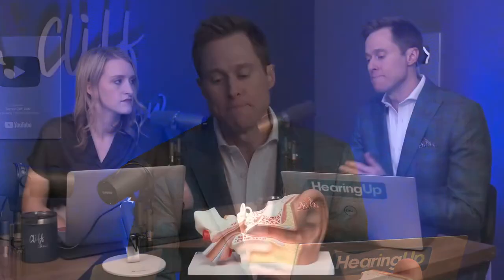But after a hearing care professional digs these pieces of information out of you, because if they're doing their job well and following best practices, it's very important to not just make it incumbent on you to share this information, but also they should be the ones pulling it out of you to some degree as well. But just be prepared that they're going to be asking a lot of questions related to these particular topics. But once they get done with that, then they're going to start rolling right into the evaluation process with you.